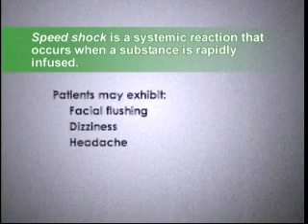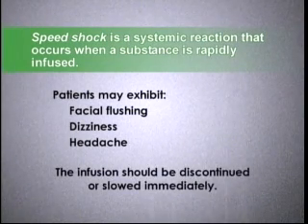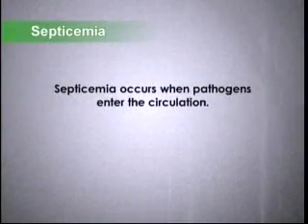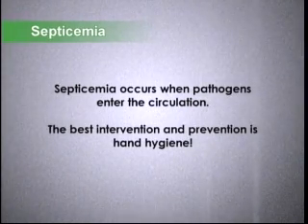Speed shock is a systemic reaction that occurs when a substance is rapidly infused. Patients may exhibit facial flushing, dizziness, and headache. The infusion should be discontinued or slowed immediately. Septicemia occurs when pathogens enter the circulation. The best intervention and prevention is hand hygiene.